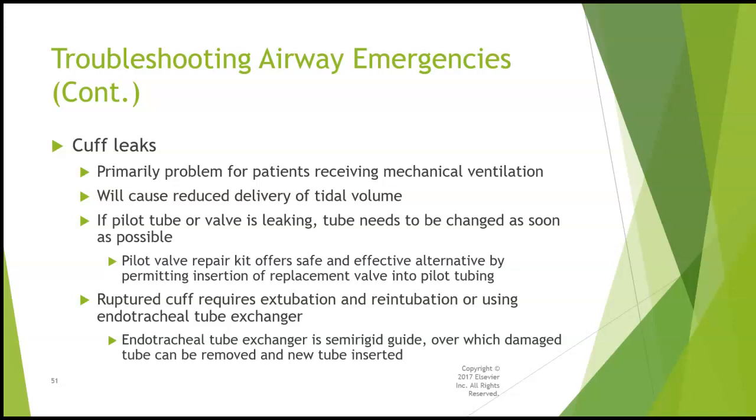So if I have a leak, this is going to greatly reduce the amount of tidal volume I'm able to deliver to the patient. Okay. So if I'm not getting good volumes in, my patient's going to be hypoventilated, meaning that they're not getting adequate ventilation, and their carbon dioxide levels are going to increase and their oxygen levels are going to decrease.